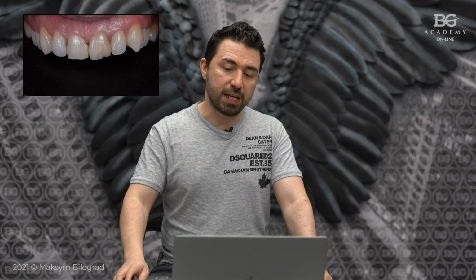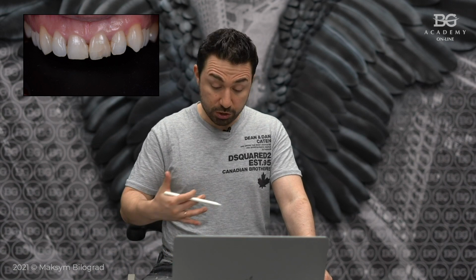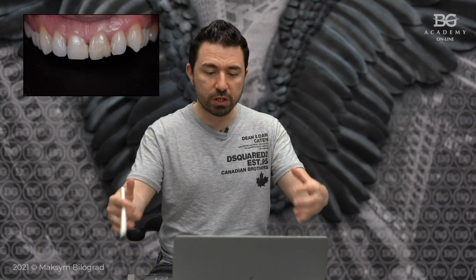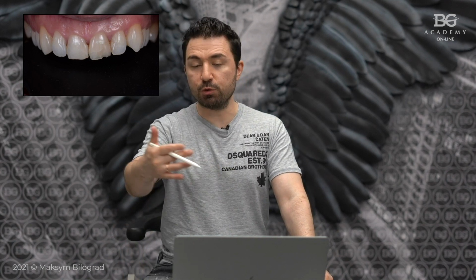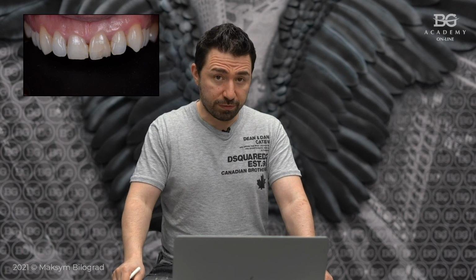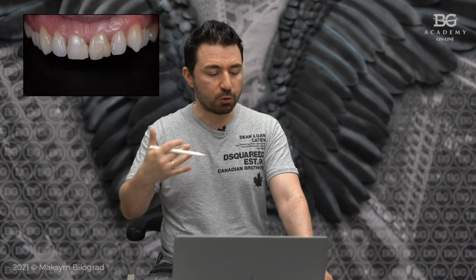Okay, so that is the initial situation. The patient asked us for veneers, and I was really aware of his canines. The canines were very prominent and protrusive. So I imagined that if the case goes to veneers, for example, how much I would need to prep these canines for making veneers. So I was about to refuse the case, but once I got enough time to plan and to see, I realized that we can.